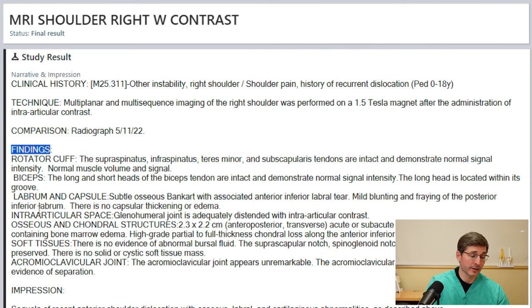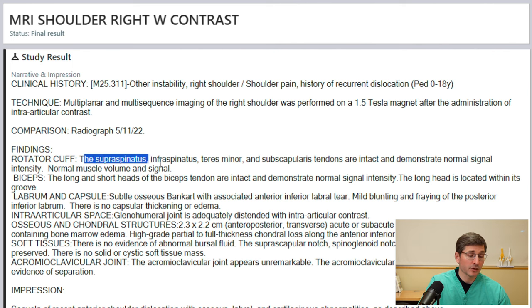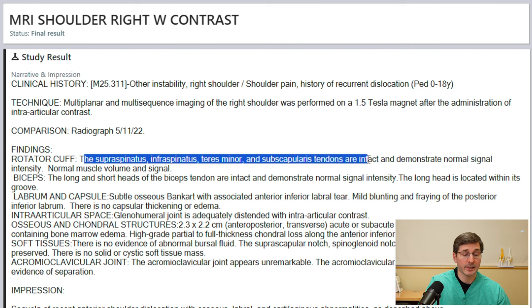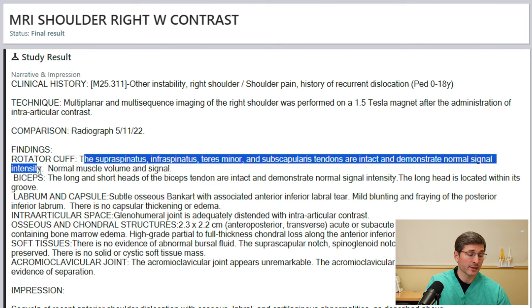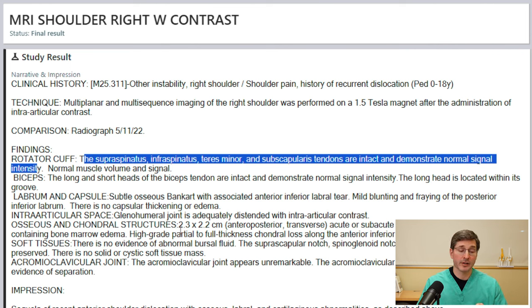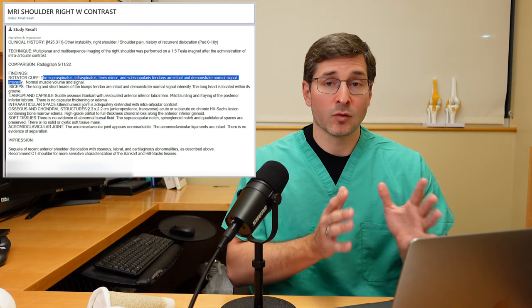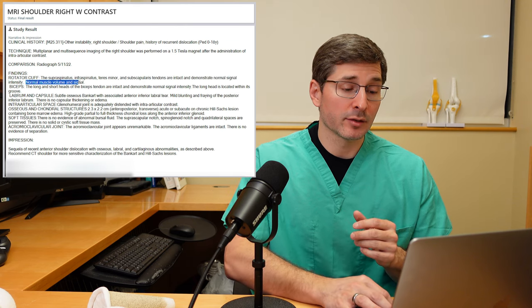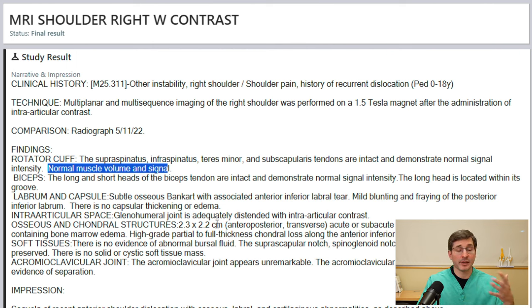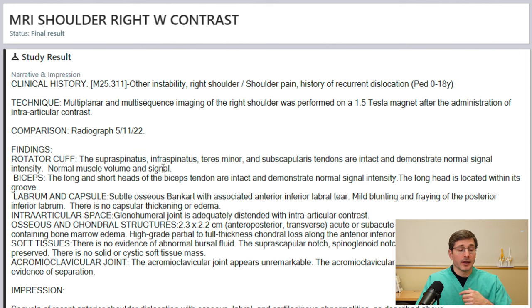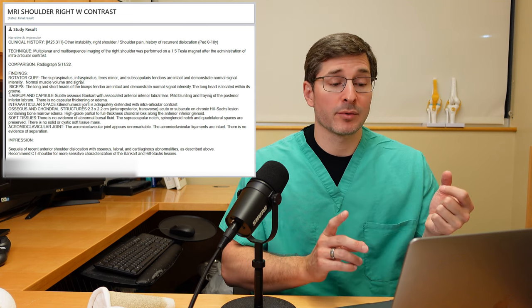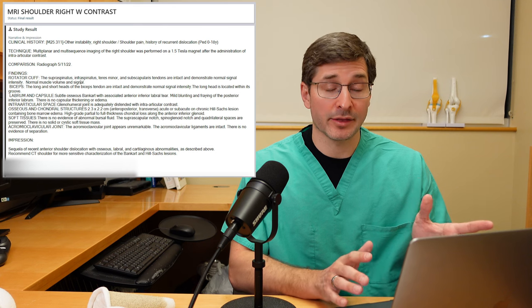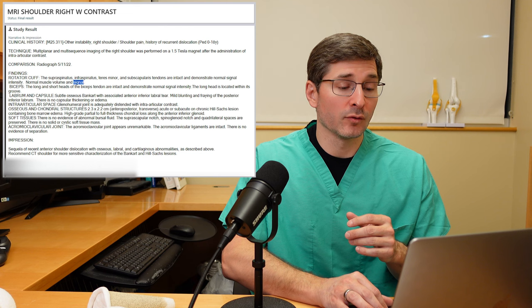Moving on to findings, the rotator cuff — the supraspinatus, infraspinatus, teres minor, and subscapularis tendons — are intact and demonstrate normal signal intensity. The radiologist has outlined all four rotator cuff tendons and finds them normal in appearance. The muscle looks normal in volume, meaning there's no atrophy or chronic change to the muscle. Normal signal means normal appearance on MRI; an abnormal signal could represent trauma, neurological injuries, or other pathology.